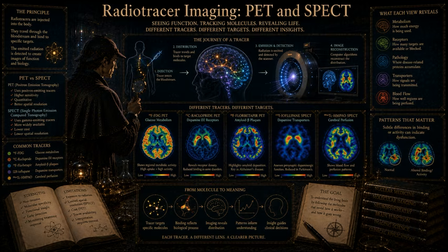Well, let's delve into that logistics issue, because when you read about the half-lives of these isotopes, you realize that radiotracer imaging is essentially a race against a ticking quantum clock. The half-lives dictate the entire workflow of the hospital or research center. Oh, the logistics are incredibly demanding, particularly for PET.